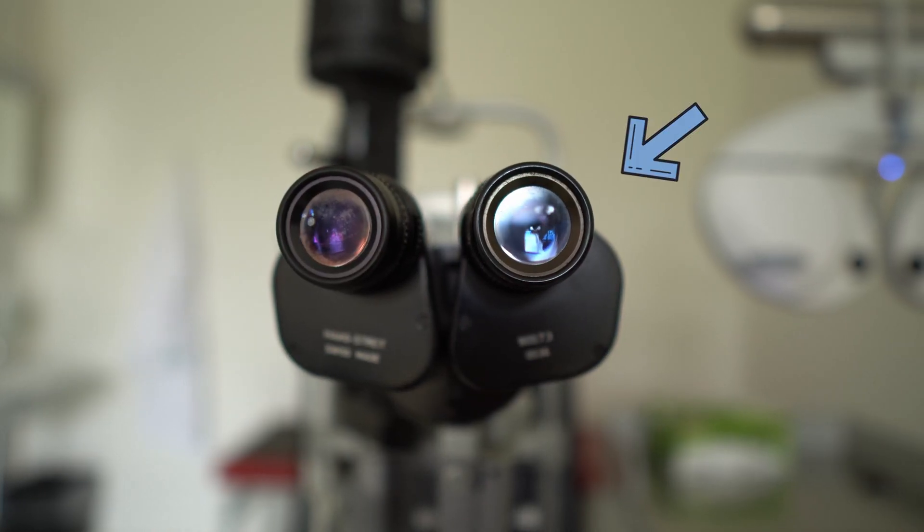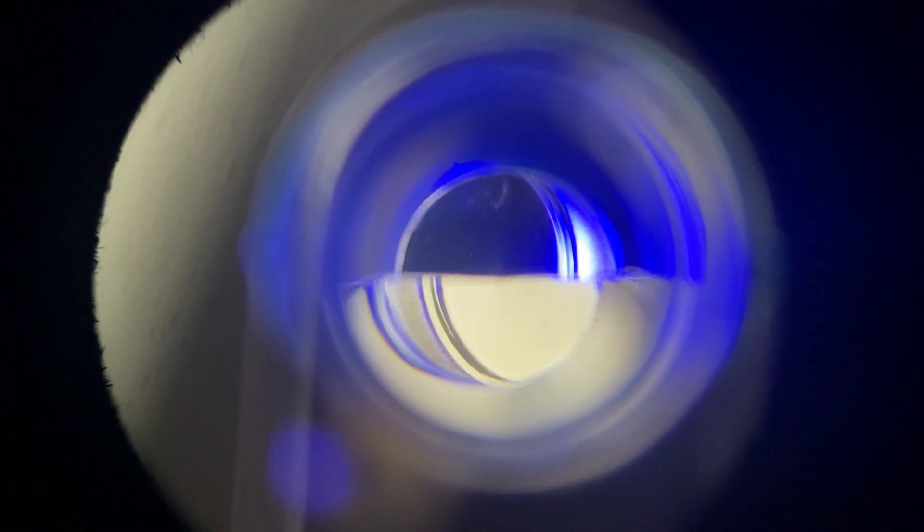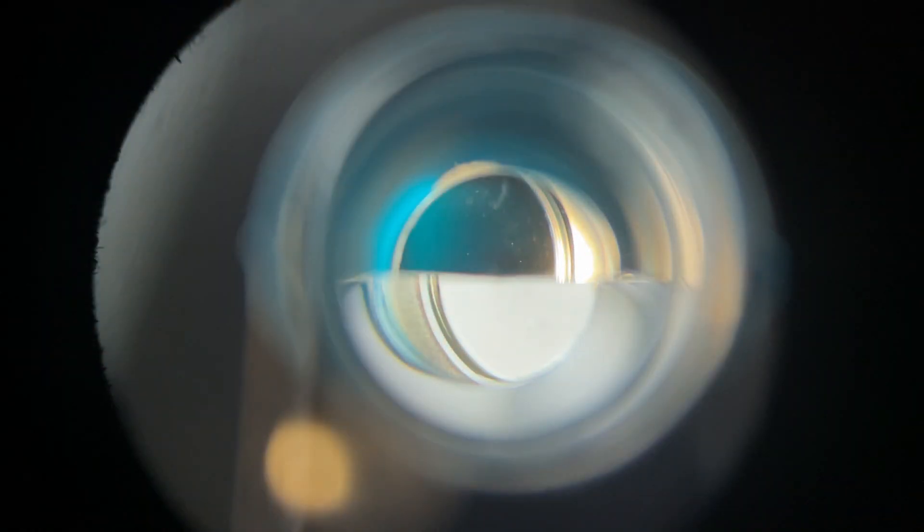Now look through the eyepieces of the slit lamp. Note that during the whole measurement you're only going to see with your right eye. This is the first time that you can see the prism that is built into the measurement head. For now, all you have to do is make sure that the prism forms a straight horizontal line.